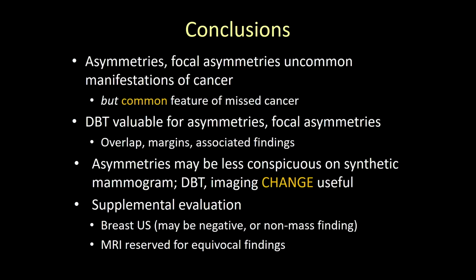And then finally, our supplemental evaluation with breast ultrasound. Remember, it may be negative, or you may actually be finding a non-mass finding, not a mass, as a correlate, and reserve MRI only for those truly head-scratching cases. Thank you.